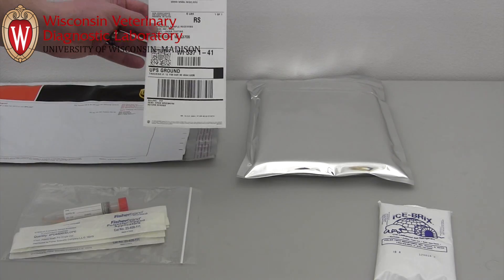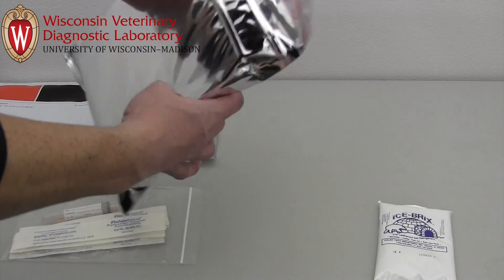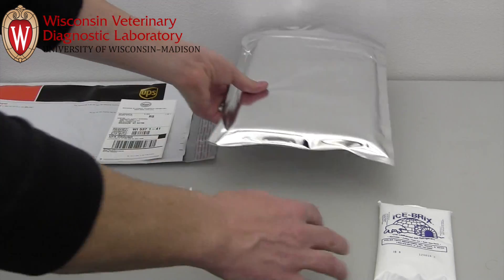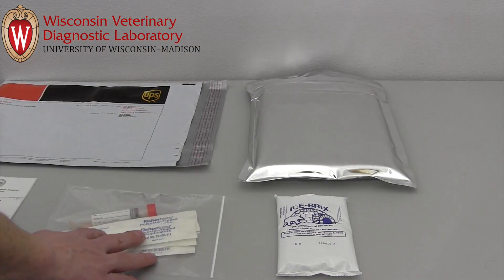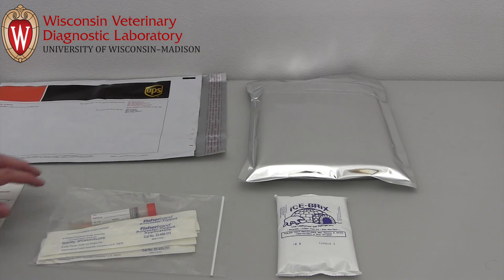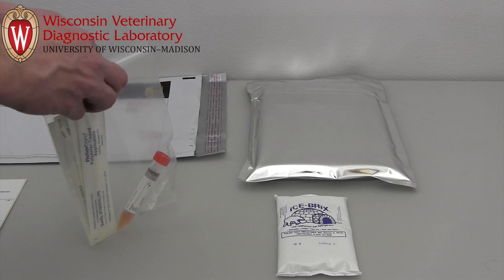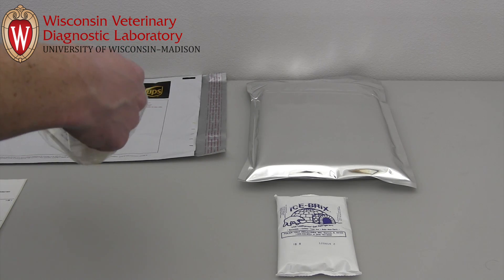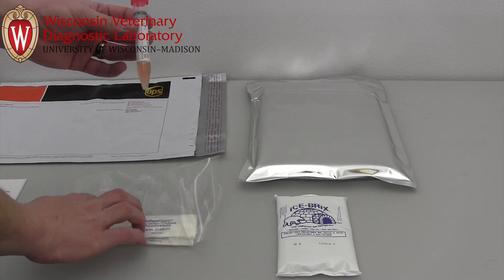The sampling materials will include a return shipping label, a padded insulated envelope, an ice pack, and a plastic bag with one or more tubes of broth and swabs. The plastic bag should be reused to contain the tubes for return shipping. You will need to freeze the ice pack before shipping inoculated samples to our lab. The broth is stable at room temperature until it has been inoculated.